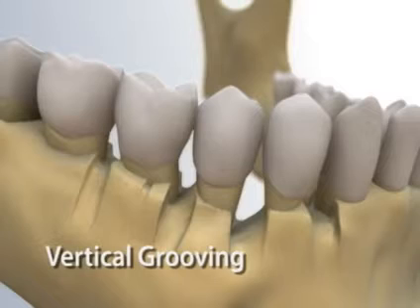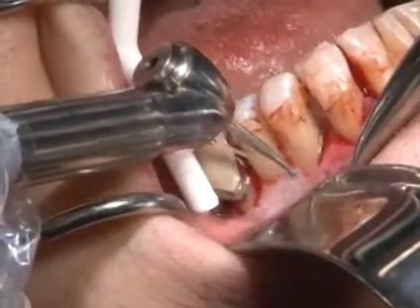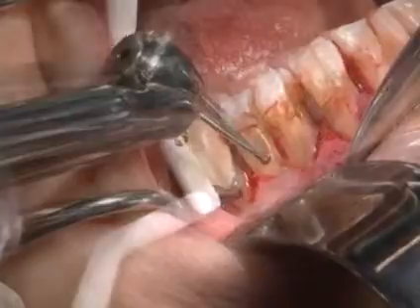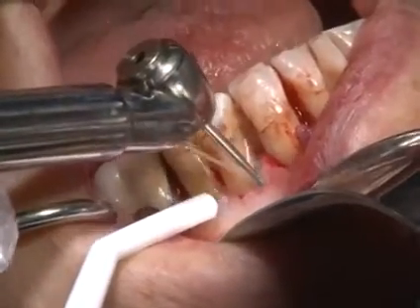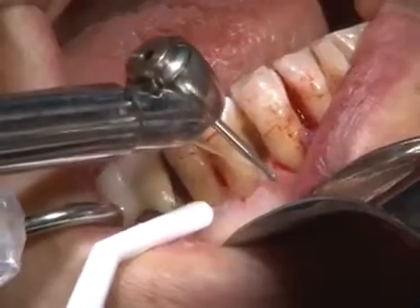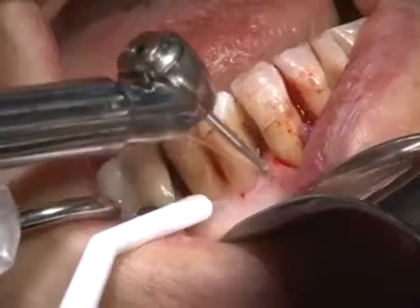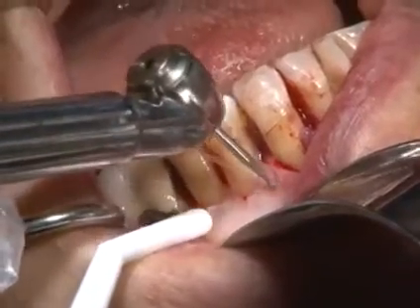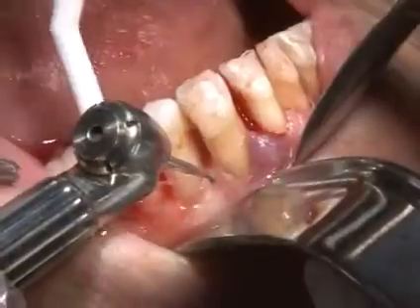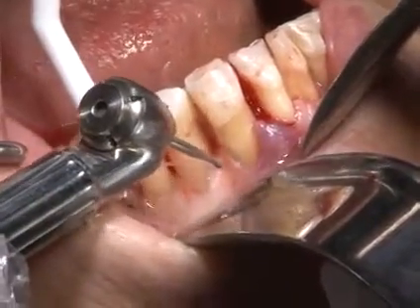The first step is vertical grooving, which involves osteoplasty of the interradicular regions. Osteoplasty is the reshaping of the alveolar bone to achieve physiologic form without the removal of supporting bone. The purpose of vertical grooving is to reduce the buccal and lingual walls of the interproximal craters, as well as reducing the alveolar housing. This will start to provide relative prominence to the radicular aspects of the teeth.